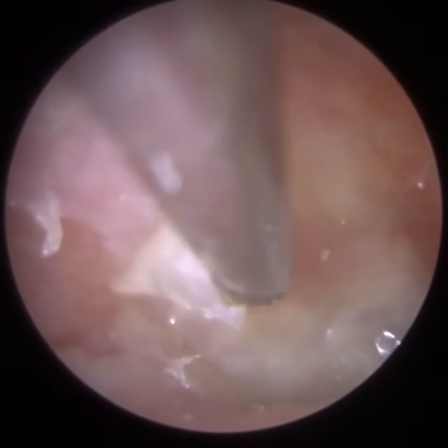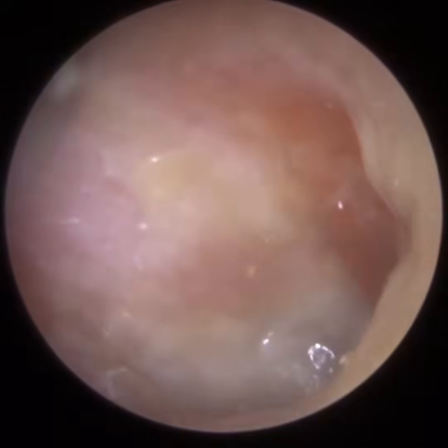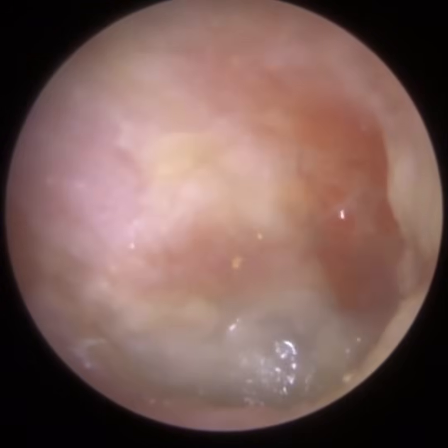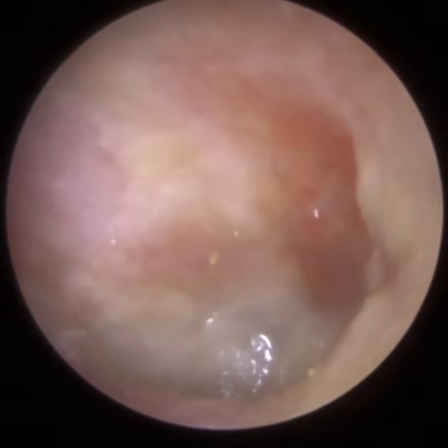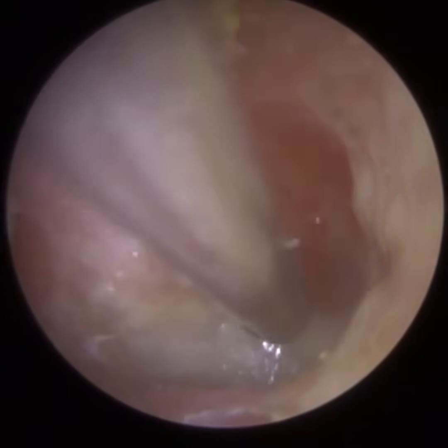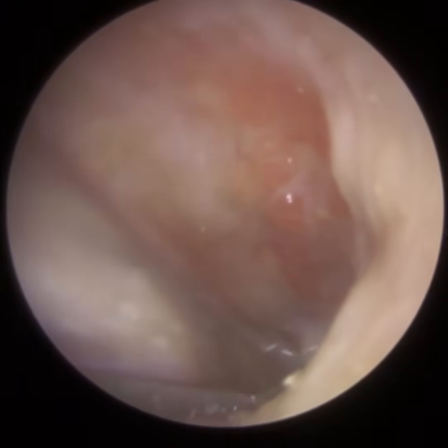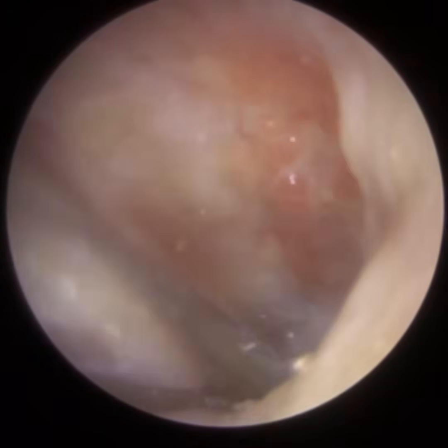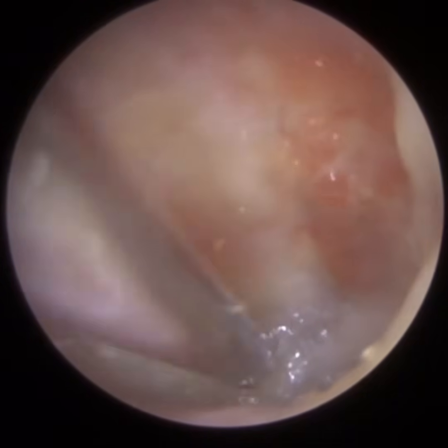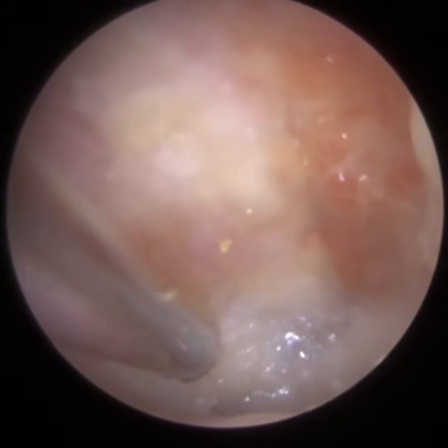Obviously it goes without saying, you need a really, really steady hand when you're doing this kind of work, so close to the eardrum. And a lot of experience, doing this for many, many years now. I've become a lot more confident, experienced, skilled in what I do. Anyone starting off, when we train our earwax delegates, we give them realistic expectations, and it could take years before they can perform procedures like this, if at all. So it's not easy what we do, especially when the patient's awake. There's no anaesthetic that we use.